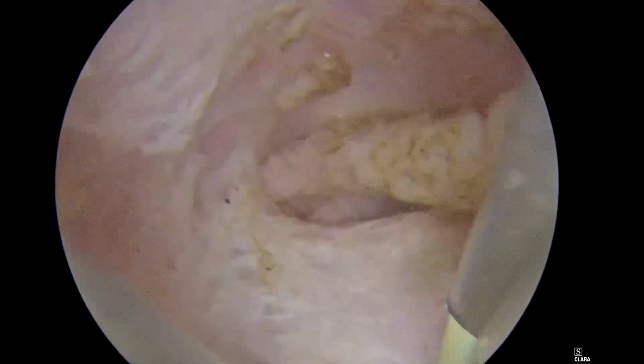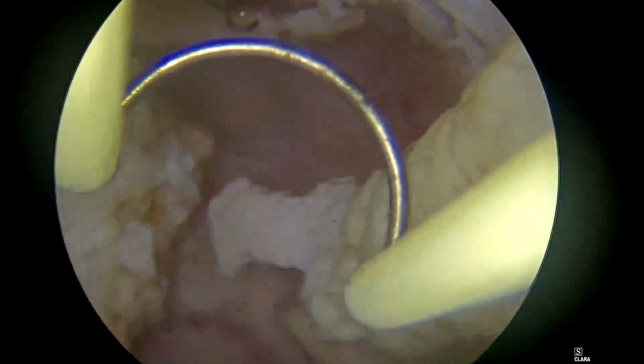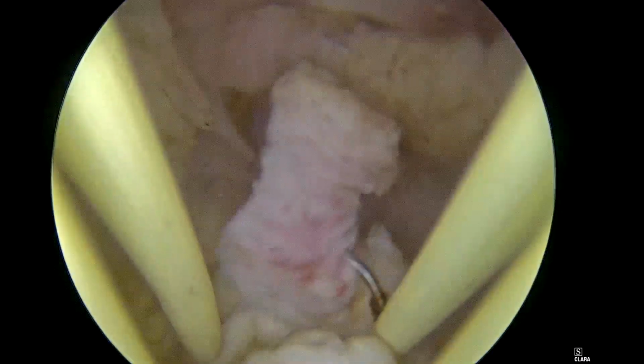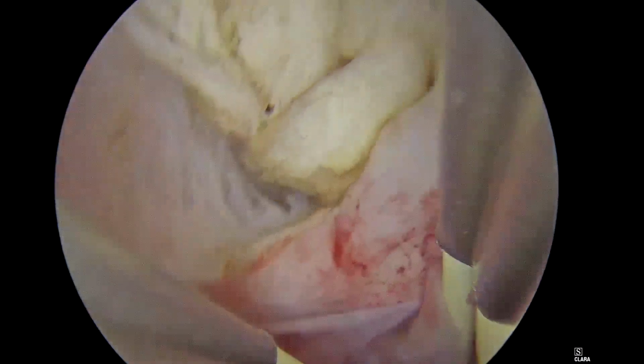Here is a backhand movement trying to detach the last piece. Everything was going smoothly, and I was explaining to the audience. There was a live transmission and people watching, and I was explaining not to go in and out, stay inside. Sometimes I use a forehand movement to cut into the myoma, and in other parts a backhand movement to detach, like in this area.